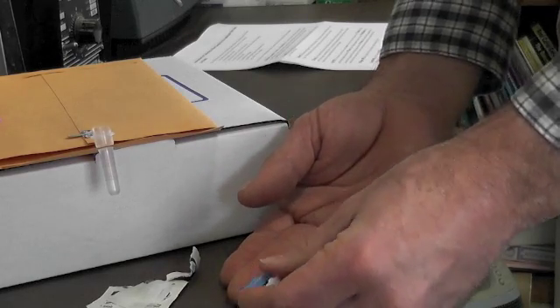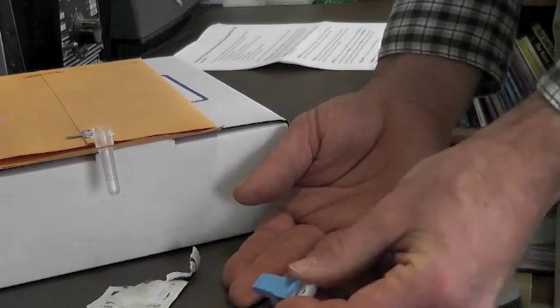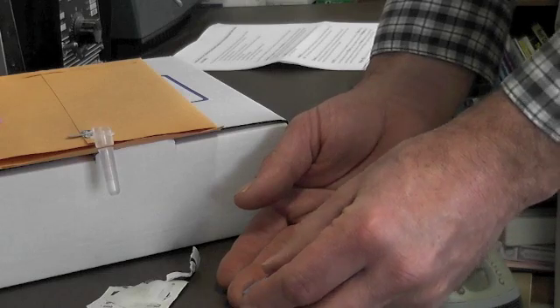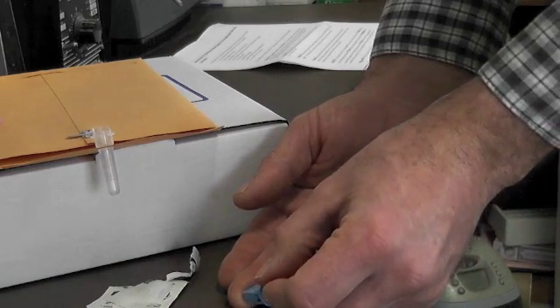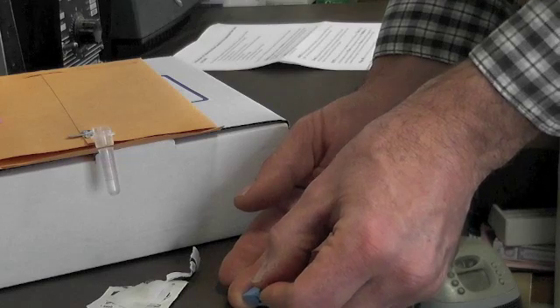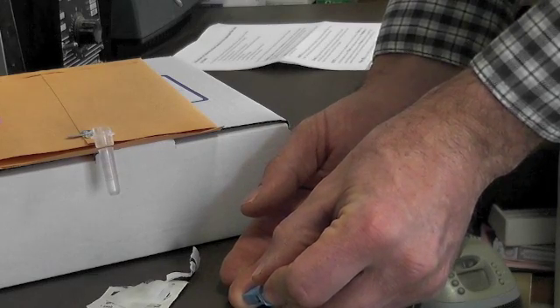You just want to set your finger on the table, press the lancet device in the right spot, pick your spot carefully. This one you're going to push until you hear it click. Don't let up until it clicks.